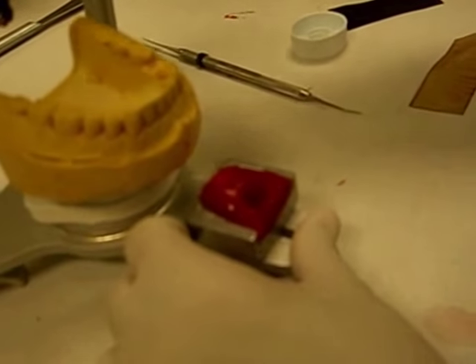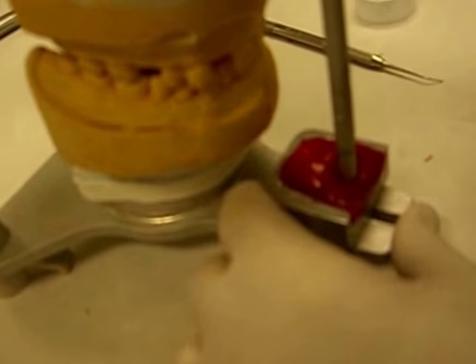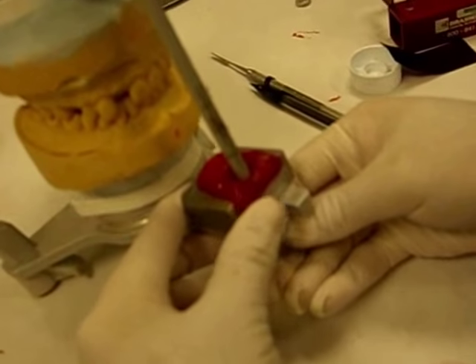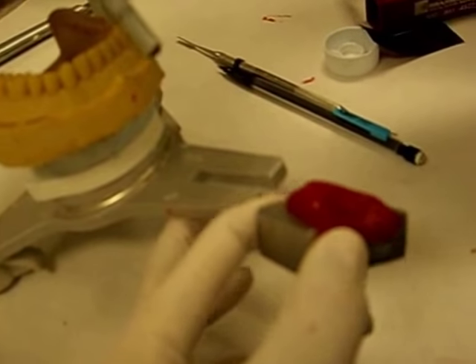We're using ultra-thin articulating paper. To remove the guide table, you just loosen the screw in the bottom and it comes right up. And it's time for you to trim it.